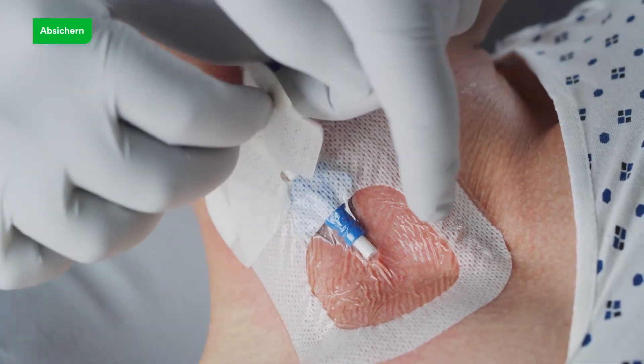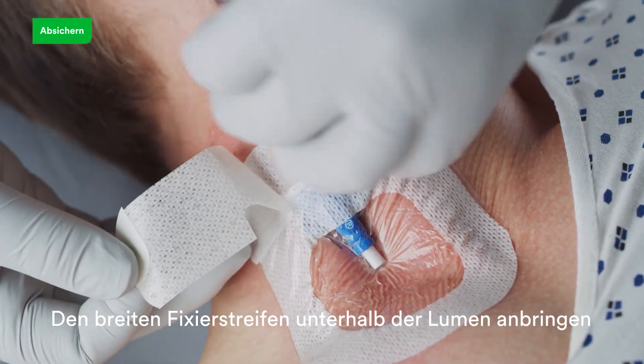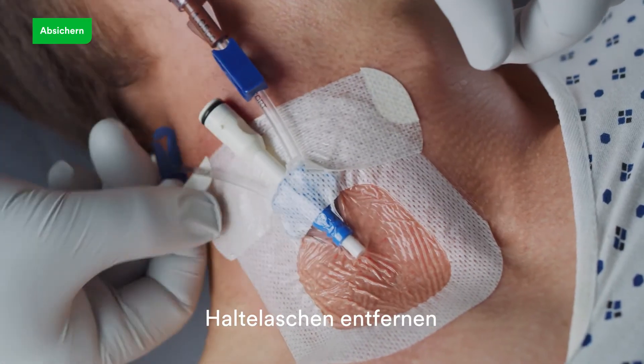Apply securement tape strip under the device tubing and overlap back onto the dressing. Remove adhesive-free tabs.